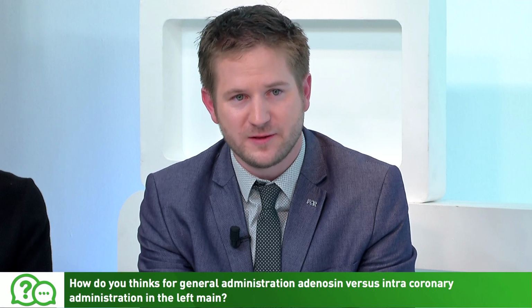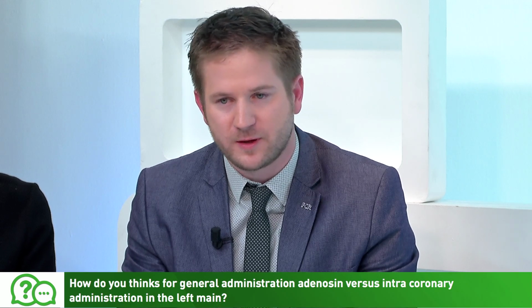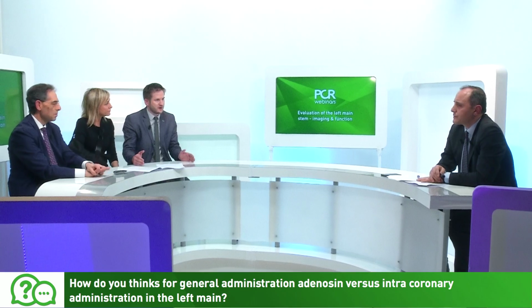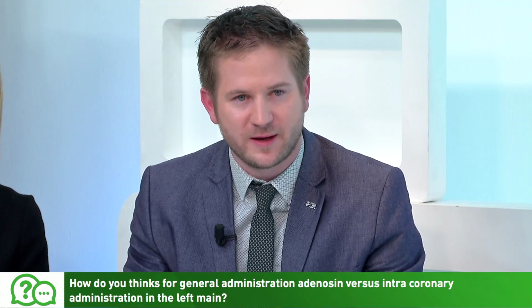Well, if we just want to understand the ischemia in the LAD territory and get one single value for the whole LAD, then intracoronary is perfect. It's quick enough, and then you get one value. If you want to evaluate the lesions one by one, so you want to perform pullback, then you need continuous hyperemia, which lasts as long as you want, and this is only achievable by IV. IV adenosine, you switch it on, you see the plateau, the hyperemia, and then you maintain this hyperemia as long as you perform the pullback, evaluate each lesion one by one, and then switch it off. So you have stable maximum hyperemia for the whole pullback. It can be done only by IV adenosine.